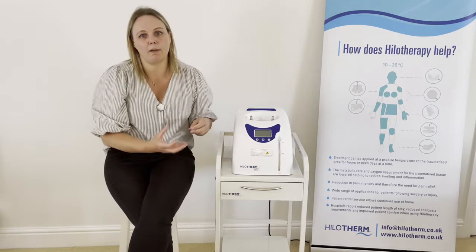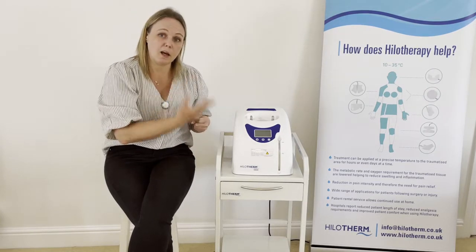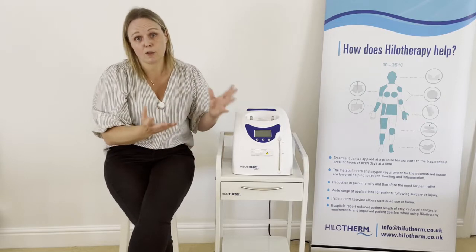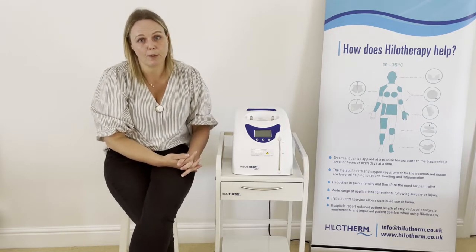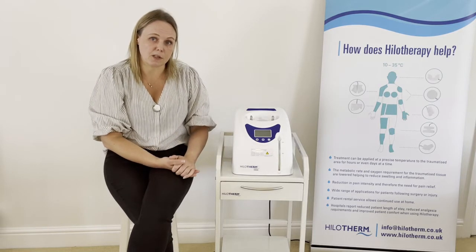There will be moisture on both the cuff and the tubing as a result of the difference in temperature between the cuff and the temperature of the patient or the environmental temperature. If that happens, you just need to increase that temperature slightly.